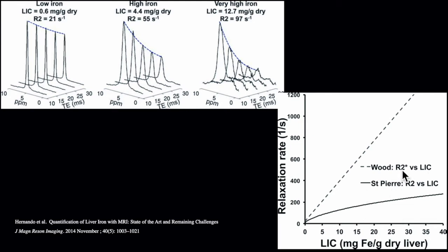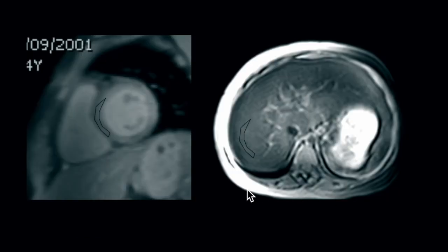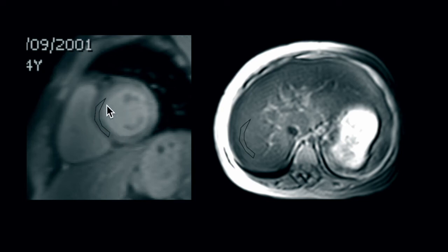R2 star represents the relaxation rate — it is simply 1 divided by T2 star. To perform the calculation, you must draw an ROI in the myocardial and liver slices. In the myocardium, the mid-septum is preferable as it is less susceptible to motion. The ROI should include as much myocardial tissue as possible, avoiding the cavity and blood-myocardial interfaces. For the liver, the ROI should be within the liver parenchyma, away from the margins, vessels, and biliary tree. When you propagate this ROI through slices, you obtain signal intensity values for each TE.